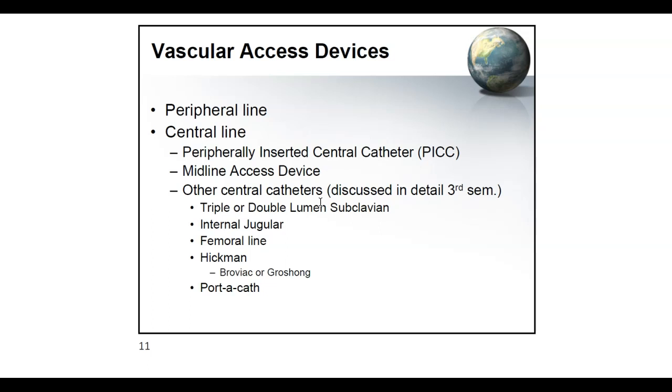Going back on the PICC line, I just wanted to point out that sometimes, depending on what's available in the facility, the PICC line may just have one port, but there are times that the PICC line may have 3 ports or 2. So just keep an eye on that and make sure that you're assessing every port. If it's 3, then make sure you're assessing all 3 and follow the protocols for care of that PICC line.